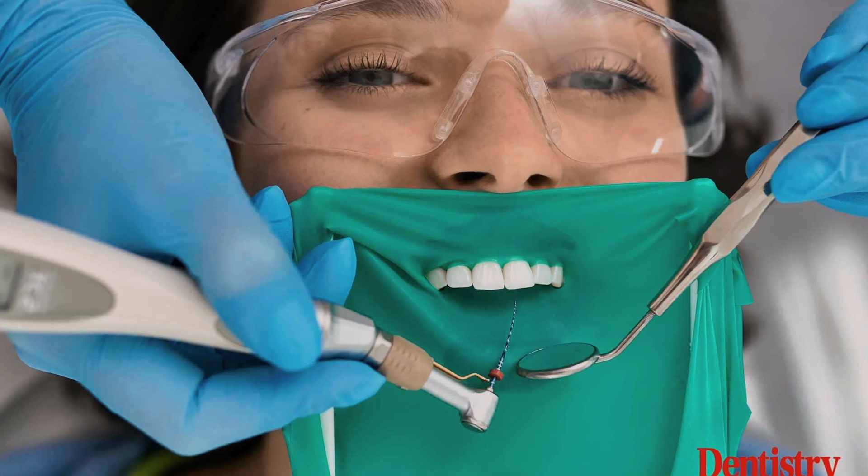First, I want to go over what a rubber dam is. A rubber dam is placed on a tooth or several teeth in order to provide isolation from several factors. One is that it provides isolation from one of the biggest barriers to successful dental treatment, which is your saliva, your mucosa, and your tongue. Moisture is a big barrier to materials curing properly, so it isolates the saliva and the tongue, and also makes it less likely that an injury may occur — because when you're drilling, especially on the mandible, if your tongue is in the way or a patient moves suddenly, it can be very dangerous.